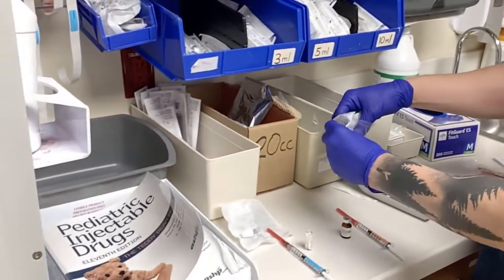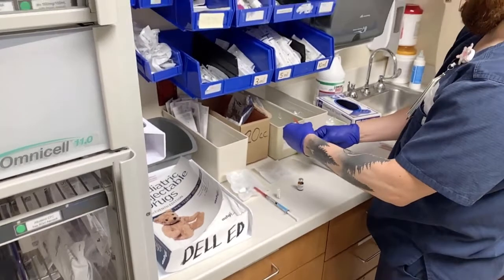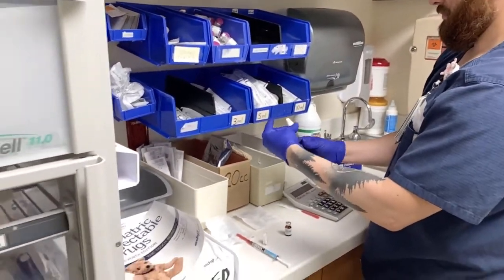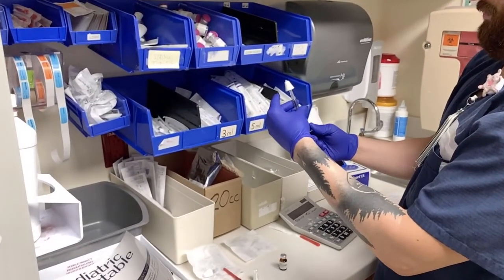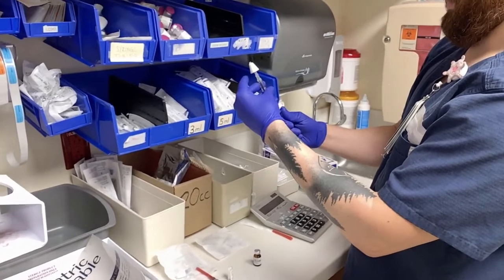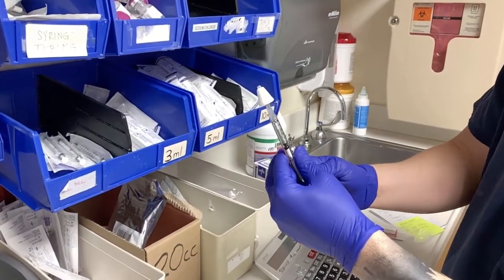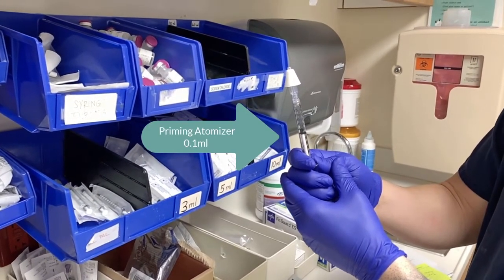After double checking all, label all medications and prepare the equipment. One atomizer per medication must be used, and we open the atomizer and secure it at the top of the syringe. Again, for priming, we would need an additional 0.1 milliliters, and again, saline is not recommended for priming.